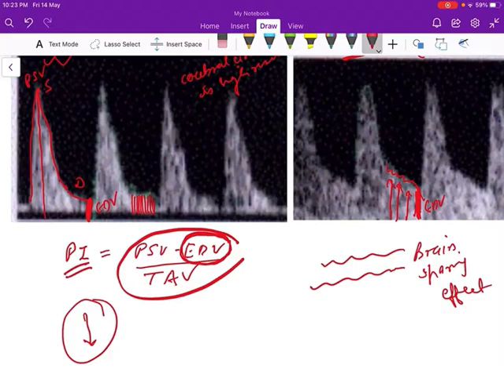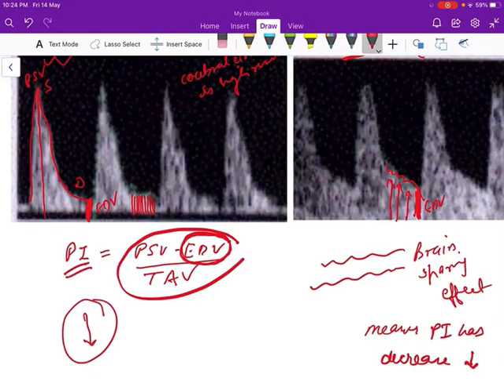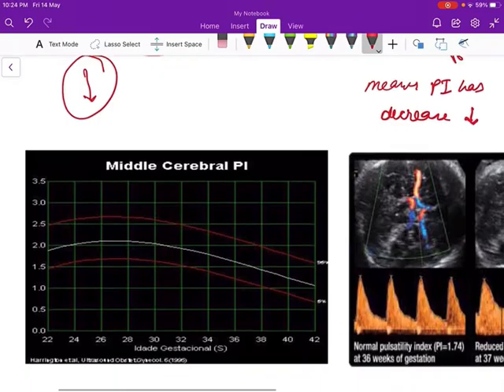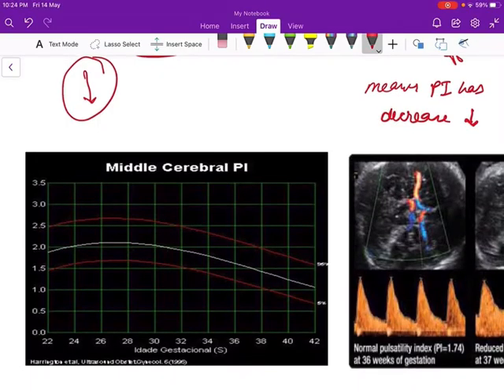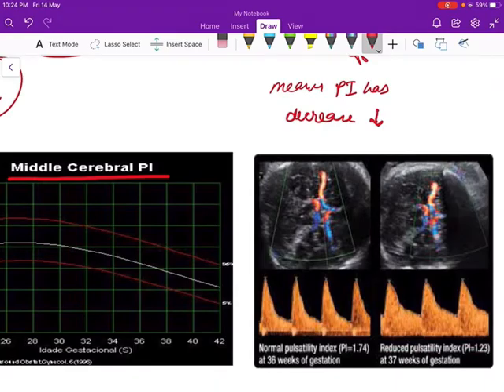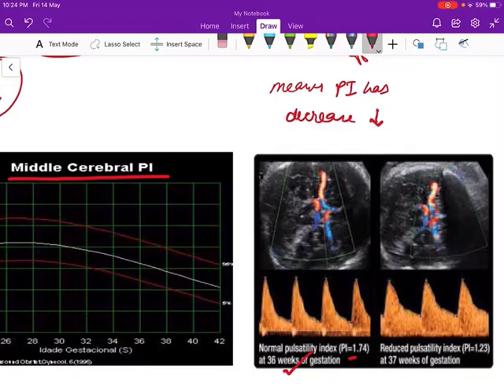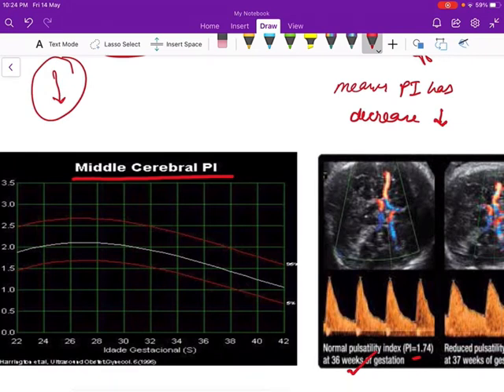This decreased PI is plotted on the normogram for PI of the middle cerebral artery. Looking at the first example: this is a normal pulsatility index at 36 weeks of gestation — a PI of 1.74. Let's plot this PI value on the normogram at 36 weeks of pregnancy. The PI of 1.74 lies somewhere here.